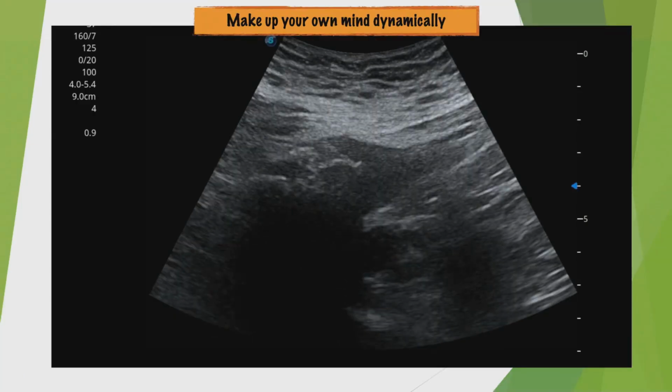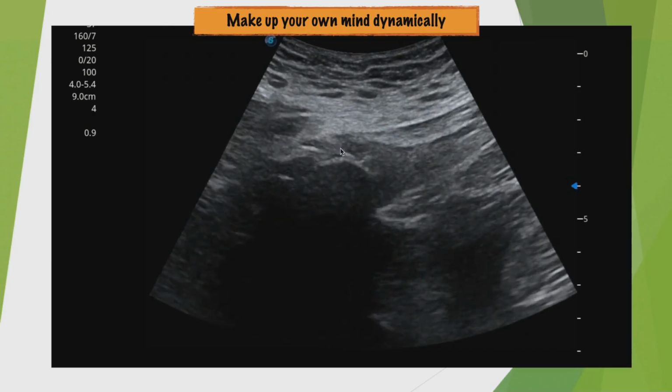Very important point, because here I'm showing you still images. We always get an idea of the problem in dynamics. Ultrasound is a dynamic field. Next, we take photos to print our reports. But for us practitioners, it's really in the dynamic that we're going to come out on top. Here's a sneak preview of what it's like.